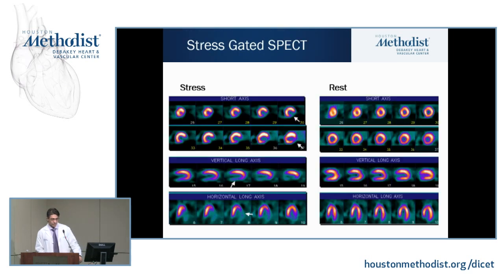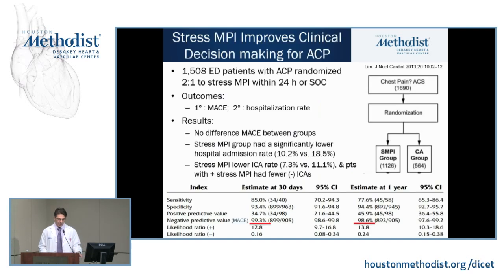What about stress rest or stress-gated myocardial perfusion imaging? This is what you are normally used to doing when you order a nuclear study. This is one study that looked at this.